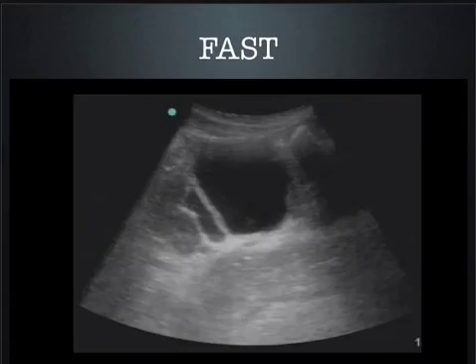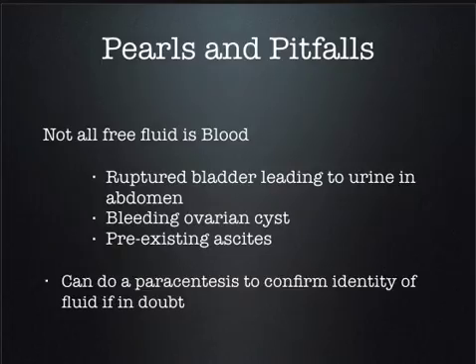All right? Here's a different one. This is a trauma patient. You can see the wall of the bladder outline. Boom! You knew immediately that was abnormal. Fluid in the bladder, fluid out of the bladder. Fluid out of the bladder. That's immediately positive. See how you can recognize that now? It doesn't take you long to know normal from abnormal. Because when you see a wall of a bladder outline, it's always abnormal.